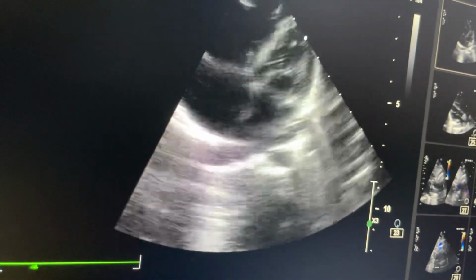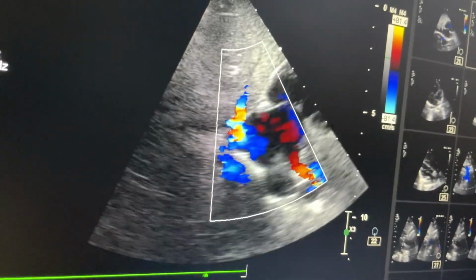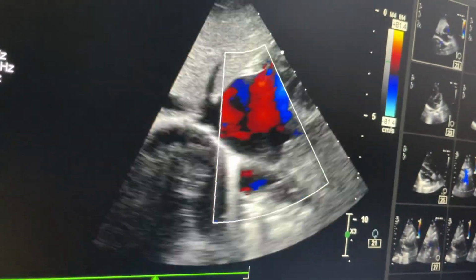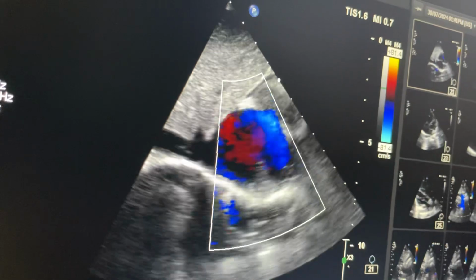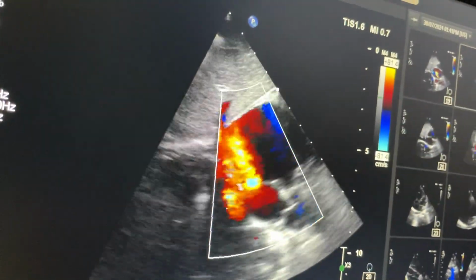So ultimately what we have learned from this image, this is sinus venosus ASD of IVC type. This bicaval view will give you the answer. Whenever you have confusion, you expect ASD but ASD is not seen easily, then in that case you have to make this view, and this view will give you the answer.